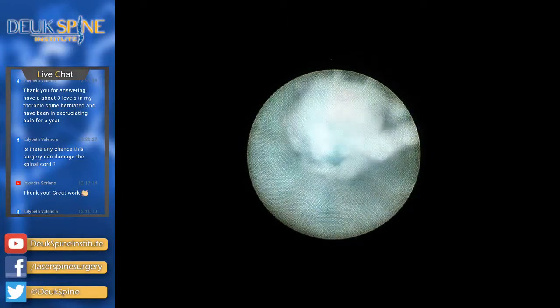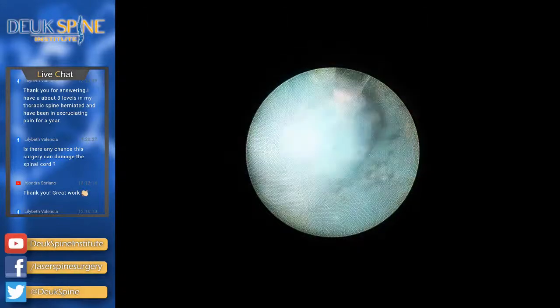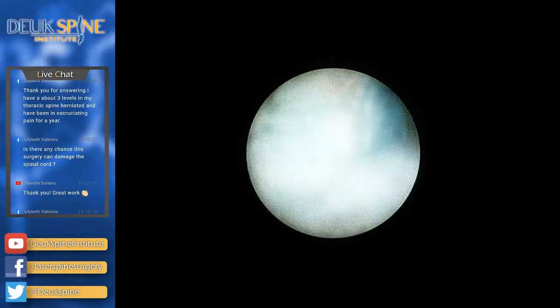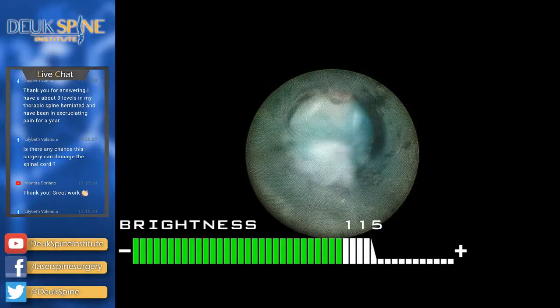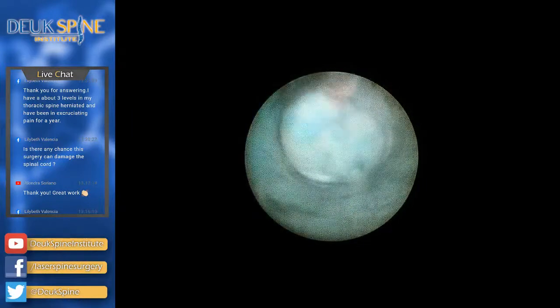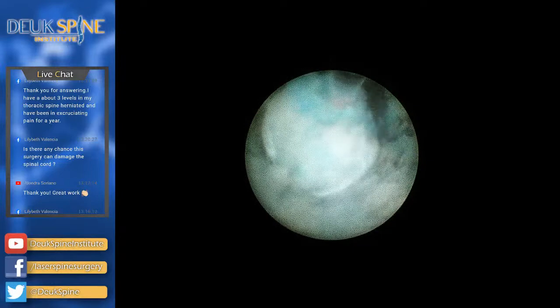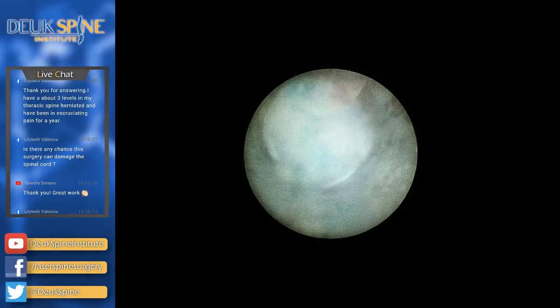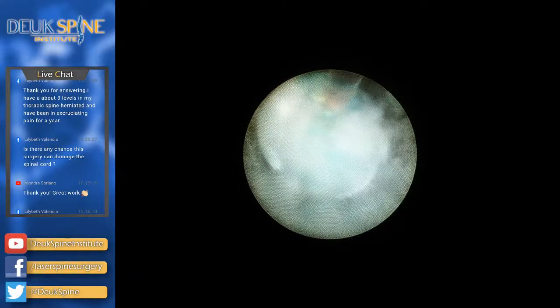Thank you. It's nicely done. A little bit overexposed on the light. Let's bring it down a notch or two. It's way too bright. That's fine. You're good. Right there is fine. So once again, herniation. Oh, look at that right there. It just erupted. That's called a reverse herniation because it's going from a place where it's not supposed to be, usually within the annular fibers or epidural space.